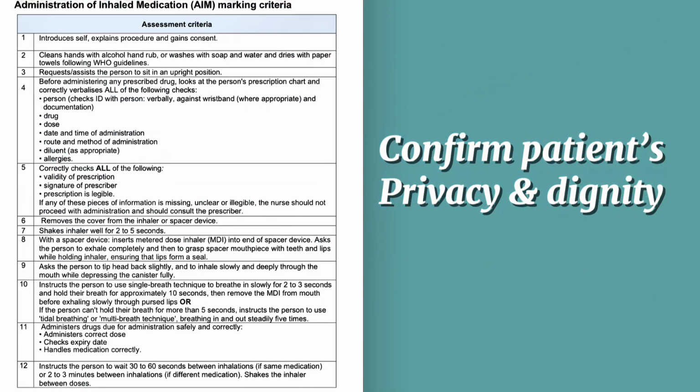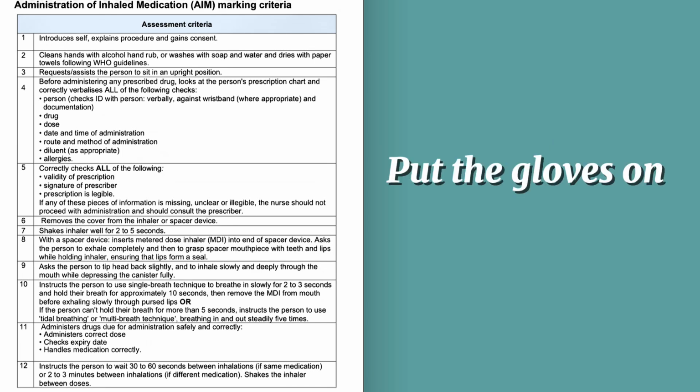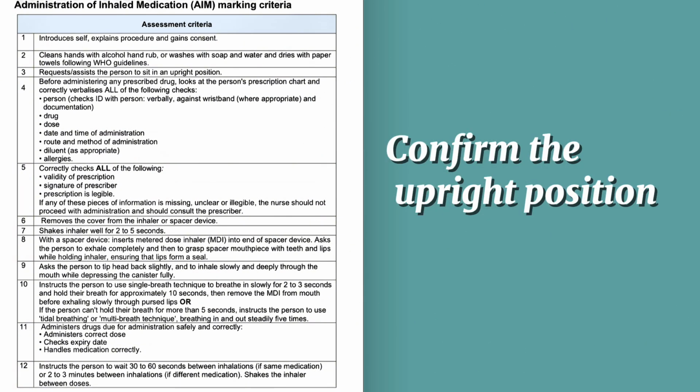Make sure that the privacy and dignity of the patient are maintained by closing the curtains and windows. Are you comfortable at the moment? So please, let me just put my gloves on. I need to make sure that you are in the upright position. Thank you for staying upright. Would it be okay if I tilt your head once we start this procedure?